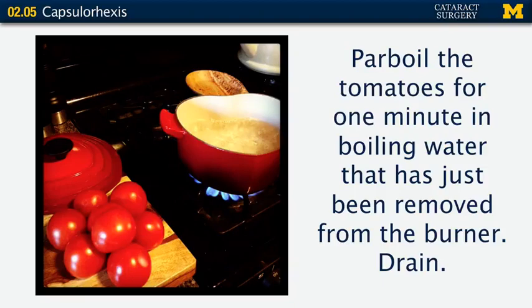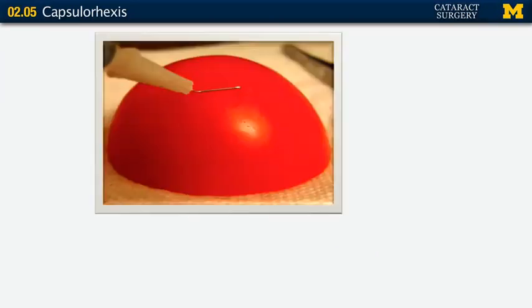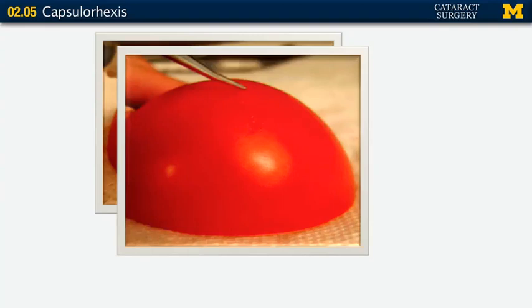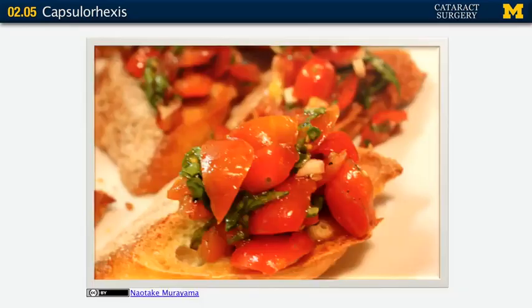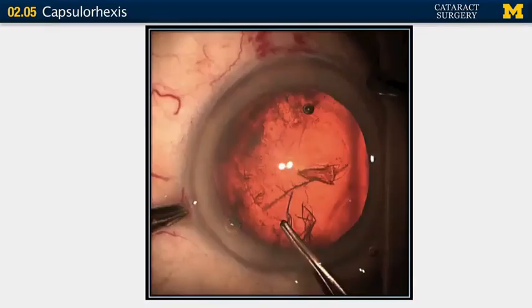You can practice this easily with tomatoes. Parboil some tomatoes — dunk them in boiling water for about a minute, take them out and drain them. Then take your homemade bent needle cystotome, make your puncture, and practice your capsulorhexis at home. Either push up a flap or pull up a flap depending on whether you're a pusher or puller, and lead it around with your forceps until you've made a nice opening. Then you can make yourself some bruschetta afterwards.